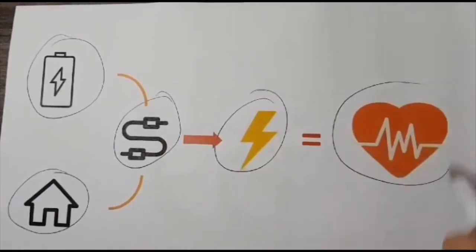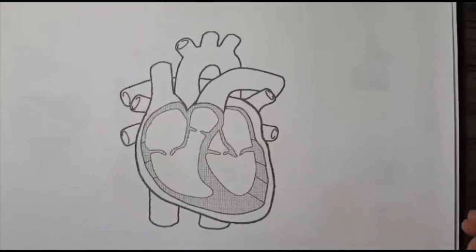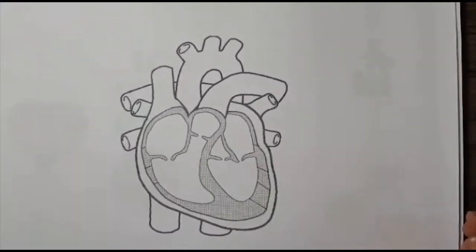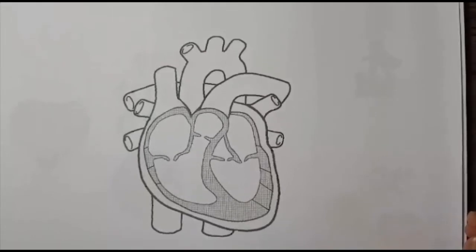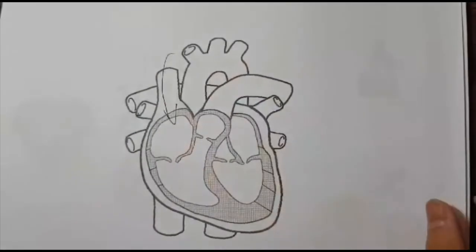The generator and its housing is usually implanted in the chest, either subdermally or underneath the pectoral muscles. Only the wires enter the heart's chambers to ensure the implanting procedure is as uninvasive as possible. The wires are fed into the heart through the subclavian vein near the shoulder, moving along the blood vessel and into the superior vena cava and into the right side of the heart.